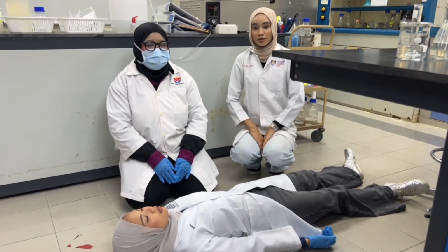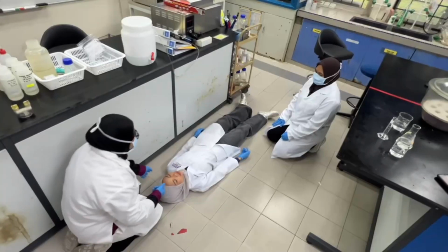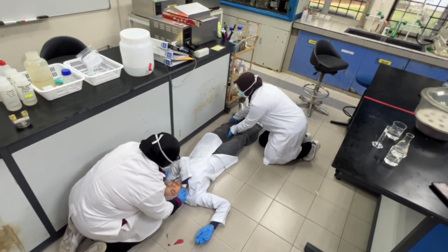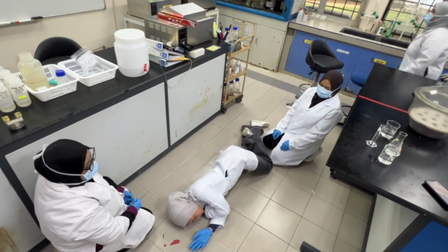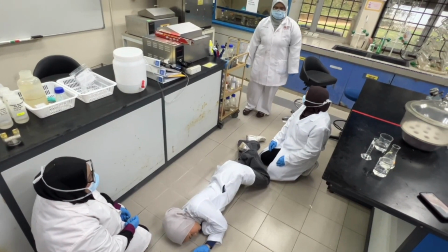Once the casualty's breathing is back to normal, the casualty should be placed in the recovery position. Emergency services have been notified and they are on the way.